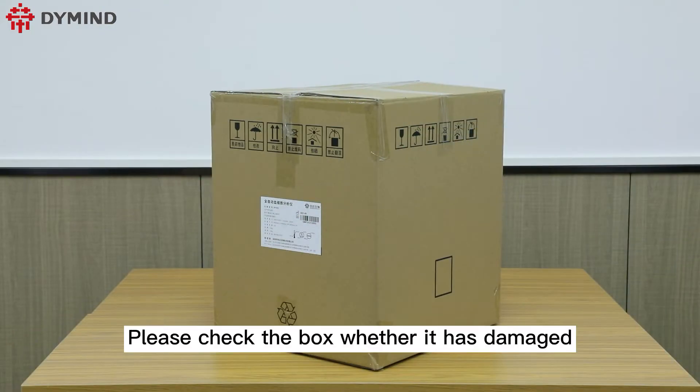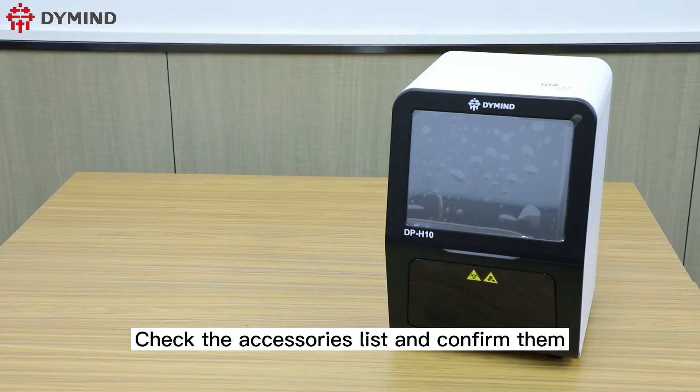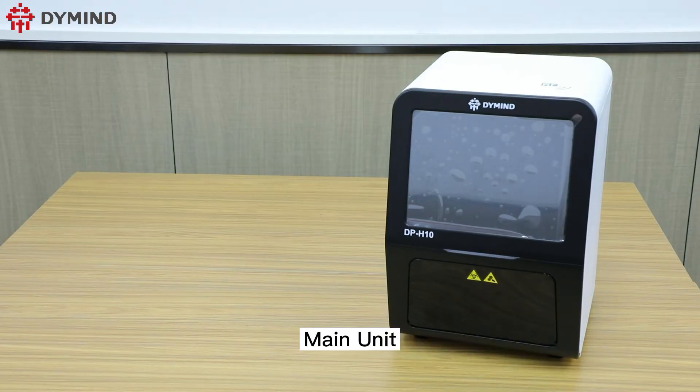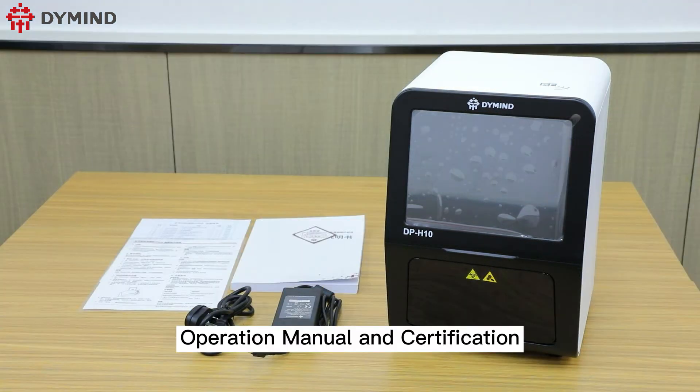Please check the box to confirm whether it is damaged. Check the accessories list and confirm them: main unit, power cable, operation manual, and certification.